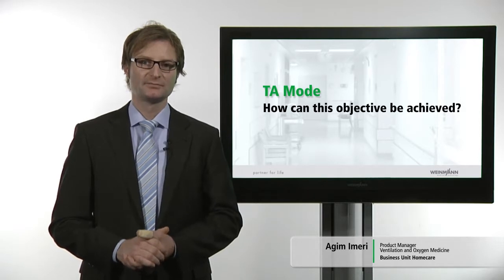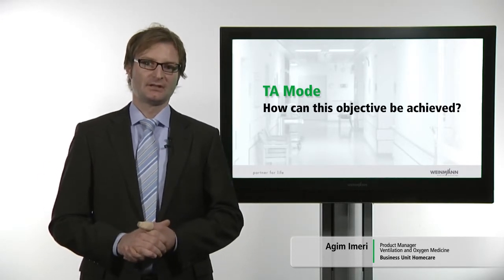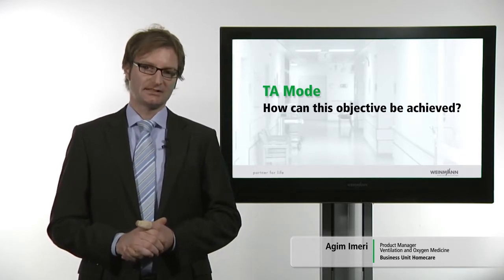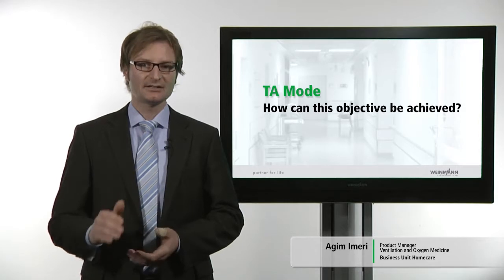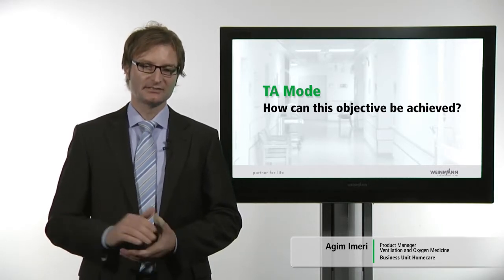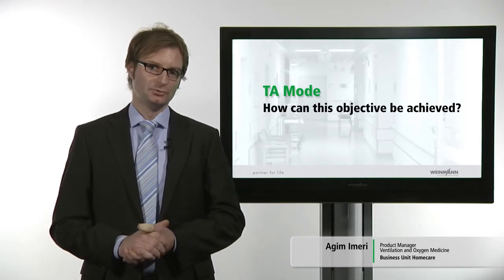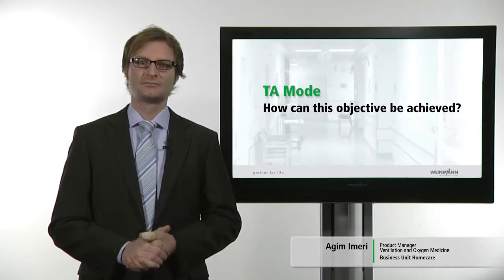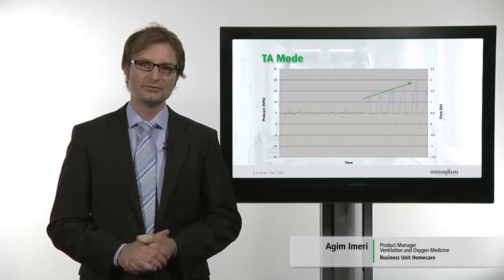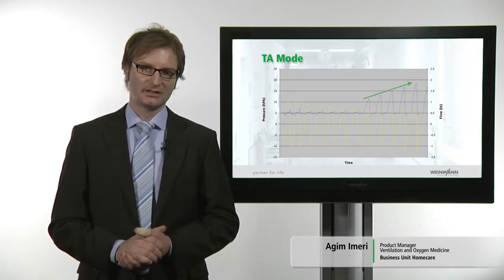When ventilation begins, the ventilator analyzes the patient's spontaneous breathing pattern. The analysis is made under CPAP over the course of 8 to 10 respiratory cycles. After the analysis, the ventilator imitates the spontaneous breathing pattern, using it in controlled ventilation mode. It's thus ensured that controlled ventilation is synchronized as closely as possible with the patient's spontaneous breathing pattern.